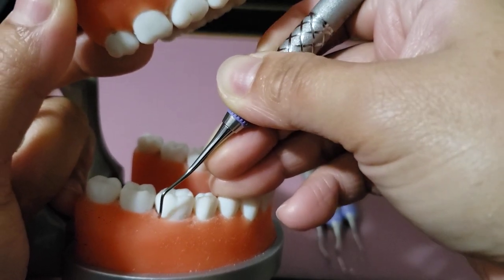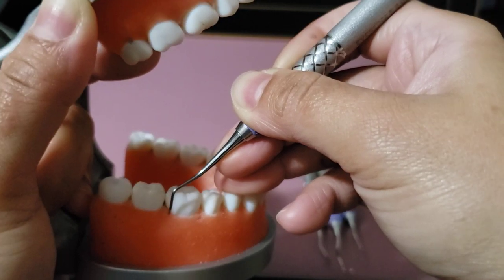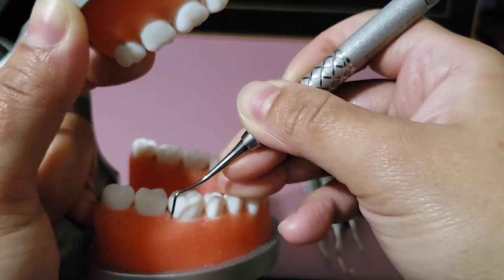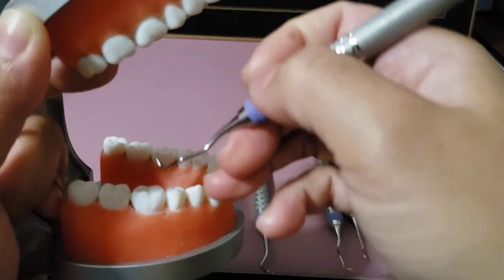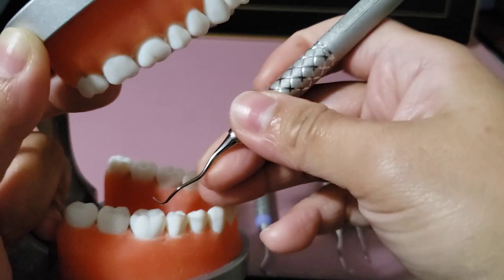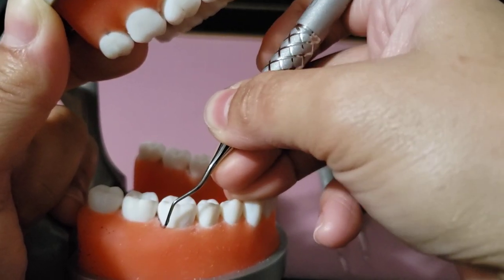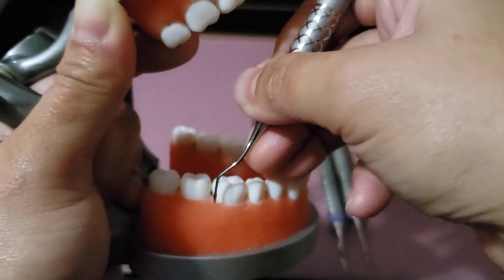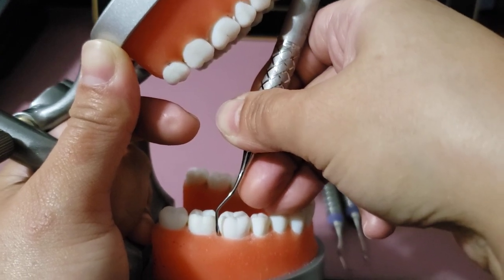Then open away to 60 to 80 degrees from the gingiva, such that the terminal shank is still tipped a little bit towards the tooth. For the Gracey instrument, the same concept applies — close, insert, open away — but this time we open it to 70 degrees such that the terminal shank is parallel to the long axis of the tooth.